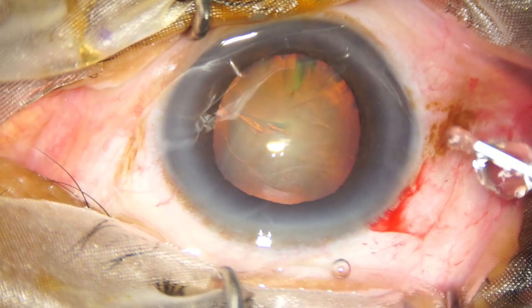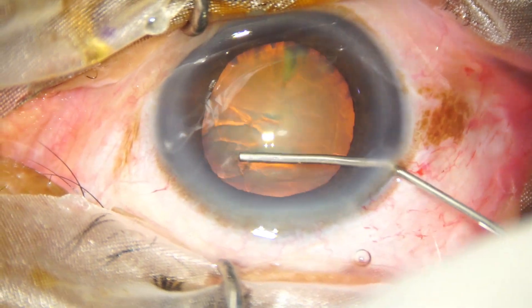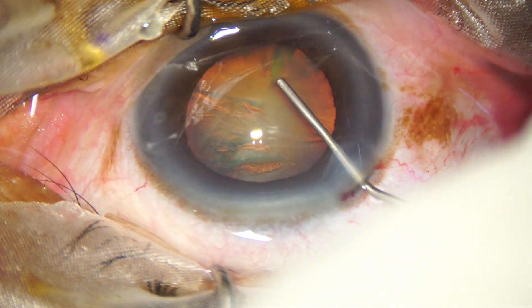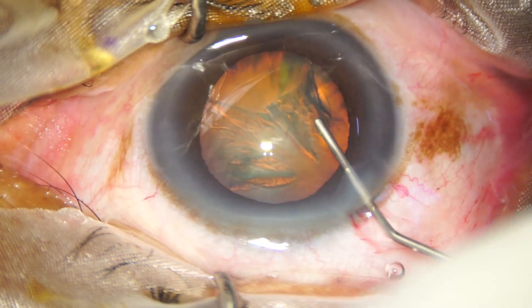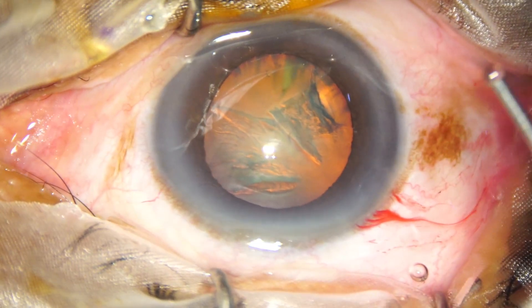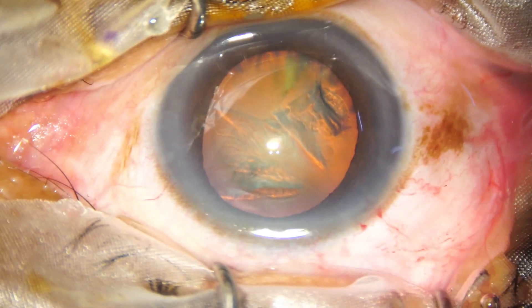Now, hydrodissection is done with BSS using a 27-gauge cannula. The pupil is constricting and dilating, so there is some floppiness of the iris.